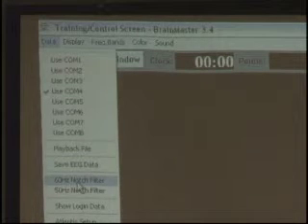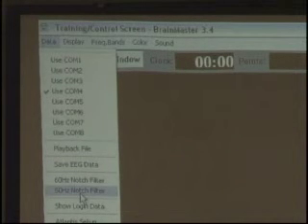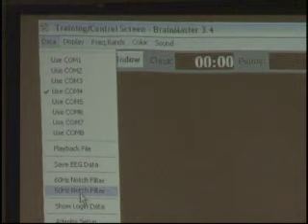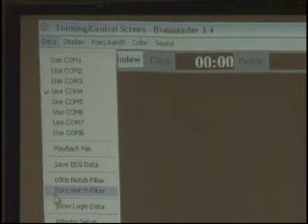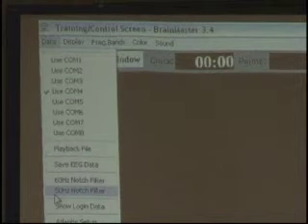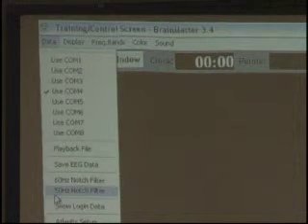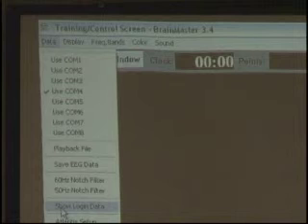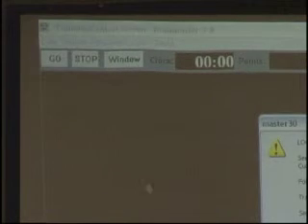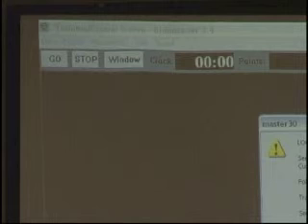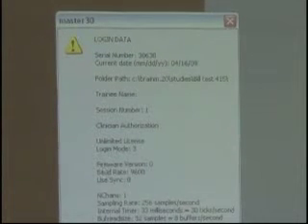We also notice our 60 Hz and 50 Hz notch filters — these are the software notch filters. I have them defaulted off right now, and that will give us a good example of why we want to do that when we start the session. We also have 'Show Login Data,' which tells us which unit we're currently logged in as and what serial number.